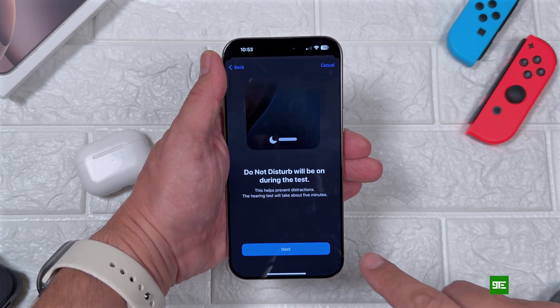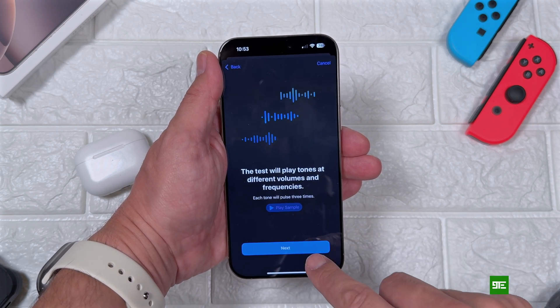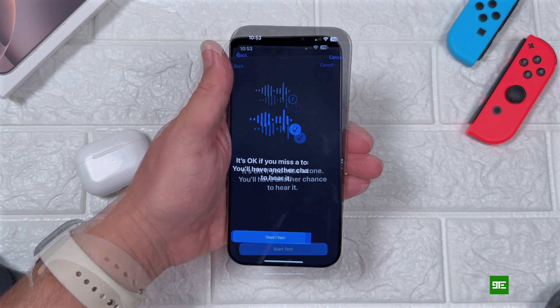Do Not Disturb will be automatically on during the test — that's a really nice addition. Then you'll see some instructions on what you need to do: tap on the screen each time that you hear a noise.